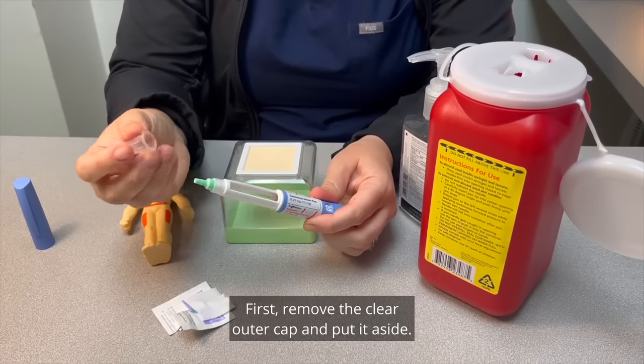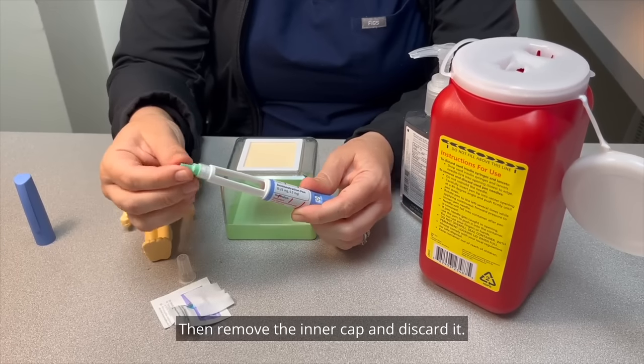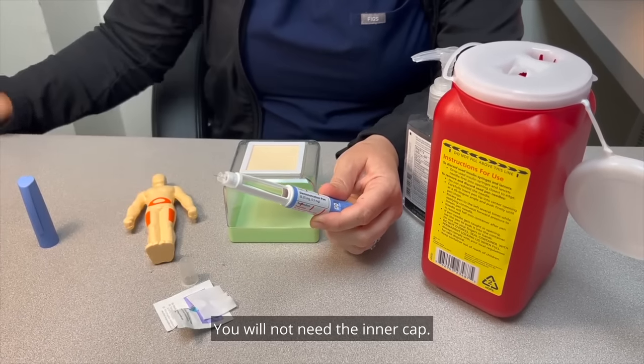First, remove the clear outer cap and put it aside. Then remove the inner cap and discard it. You will not need the inner cap.